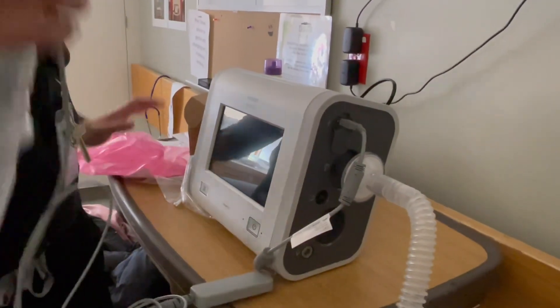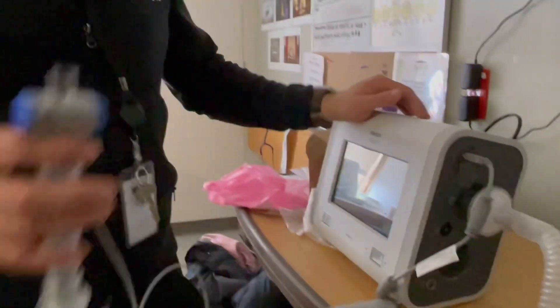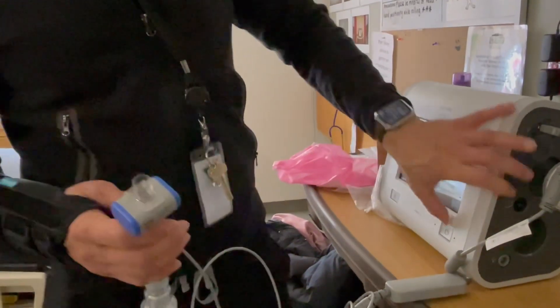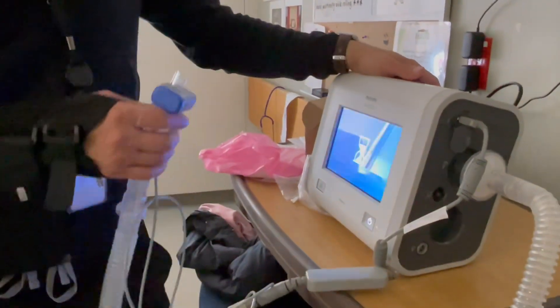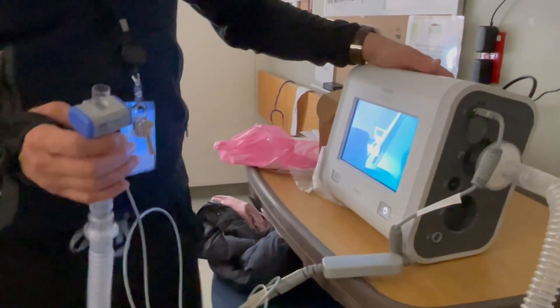I believe the other end goes through the trach. Turn this on. It's working — I calibrated it this morning just to test it out.